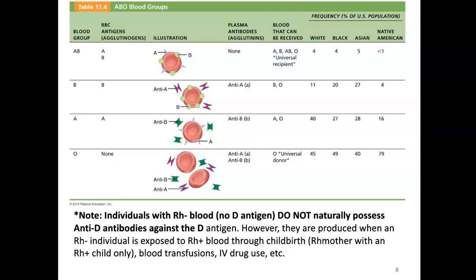You're going to take a little bit of blood and put it in a slide or in a tray that's got 3 little wells in it. One well is for anti-A serum, another well is for anti-B serum, and the third well is for anti-D or RH serum. So this would figure out your ABO blood type and then your RH, whether you're RH positive or RH negative. Just a couple of concepts as far as blood typing is concerned.